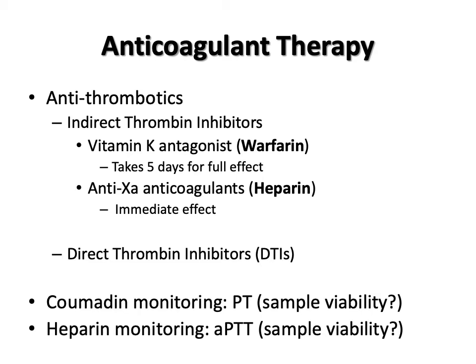Warfarin, also known by the trade name Coumadin or Coumarin, is an antithrombotic that is usually taken orally. The prothrombin time, or PT, is typically performed on patients receiving Coumadin to monitor therapy. Blood samples for PT analysis can remain uncentrifuged for up to 24 hours.